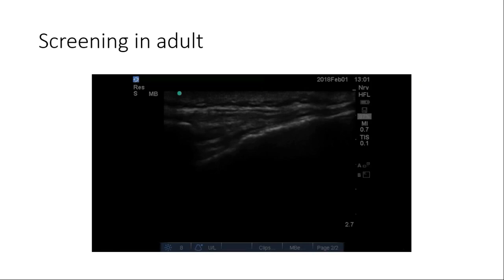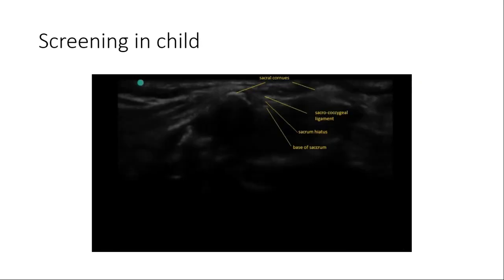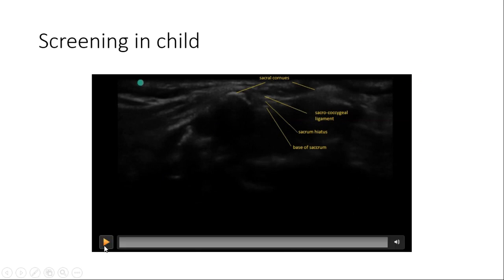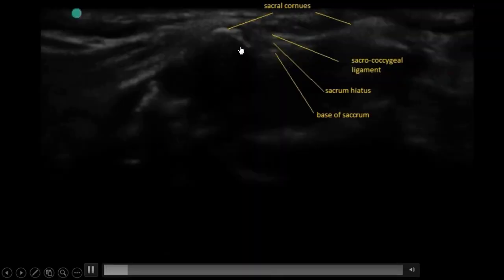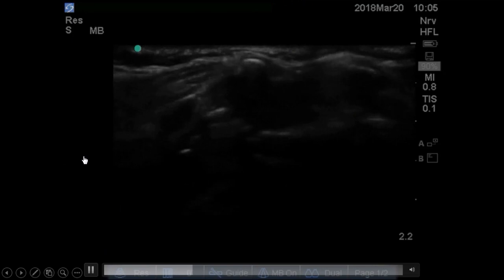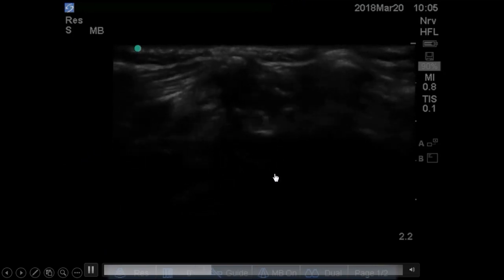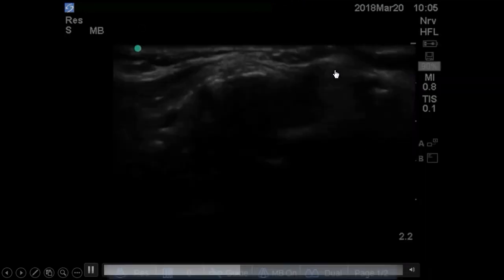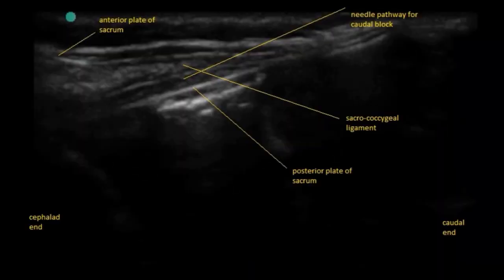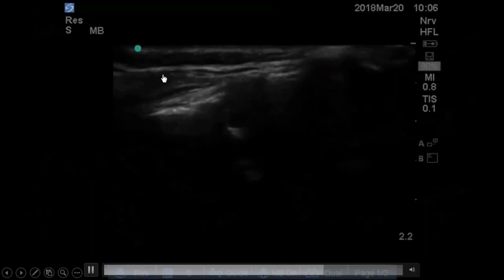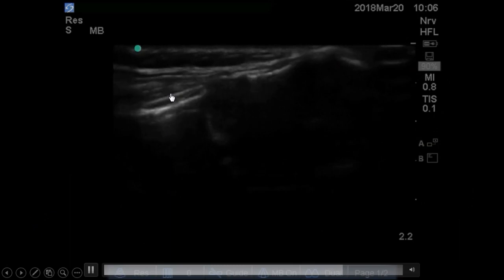Now let's see how it looks in a child. You can visualize the two sacral cornua and the sacrococcygeal ligament at the sacral hiatus, which is a small one in a child. In the longitudinal view, you can see the sacrococcygeal membrane and the black anechoic caudal epidural space.